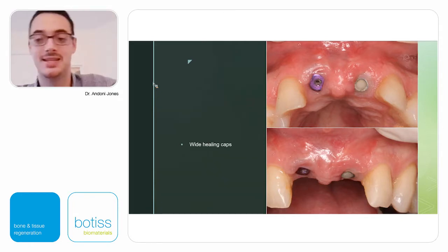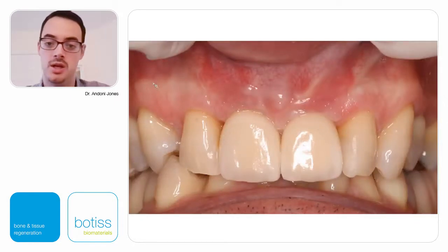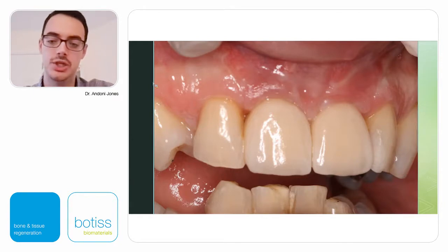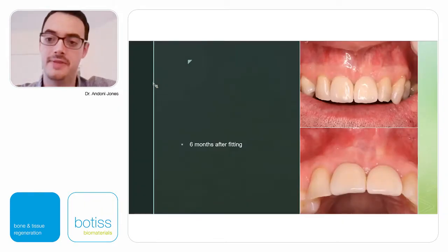We place wider healing caps, and the case can be finished straight away. You can use temporary crowns to slowly sculpt and mold tissue to the emergence profile you're looking for, or if you trust your technician and know what your temporaries should look like, you can go straight to finish. Six months after fitting, the tissues have matured beautifully — papillae look nice, the mucogingival line appears to have re-established itself, and the color is great.